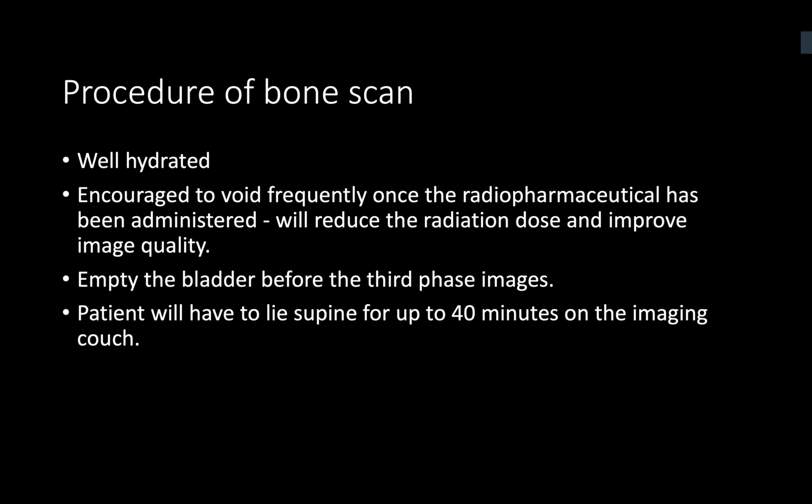So how will you counsel the patient for a bone scan? What are the precautions that he needs to be aware of? So I'll tell them to be well hydrated. I'll tell them that when they get to the radiology department, the nuclear medicine tracer will be injected, and that they will be required to return or hang around there for about 2 to 4 hours before the pictures are taken, to allow good uptake in the bones.